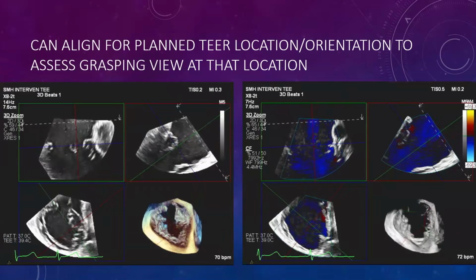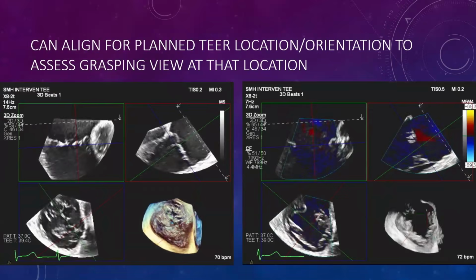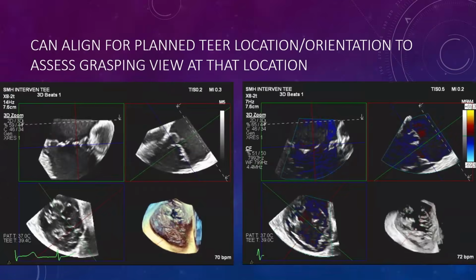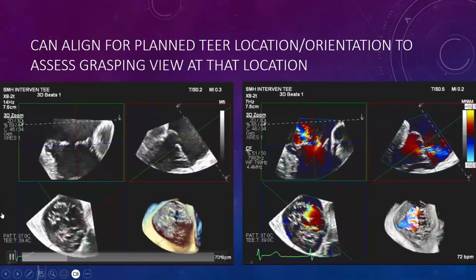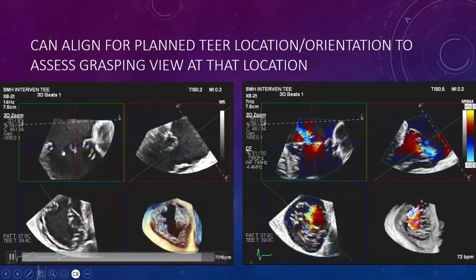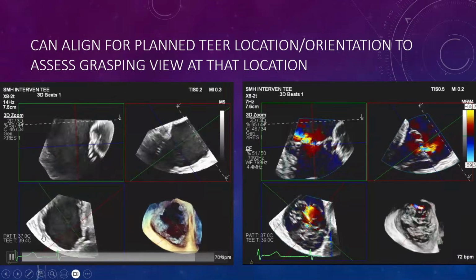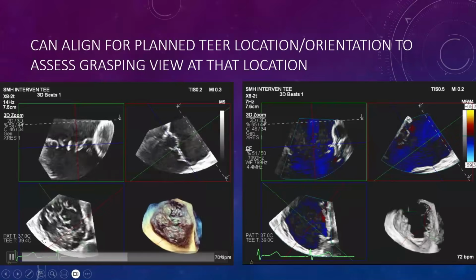And it's also helpful in terms of aligning things, and if we aren't able to get our mid-esophageal view nice and flat so that we're sweeping through it directly with our cursor up and down, we can create a 3D data set and then interrogate the valve in a similar way, creating our typical bicommissural view with our sweep, and then our transgastric view, which is the only view where you're able to see on transthoracic or transesophageal echo all of the leaflets simultaneously.